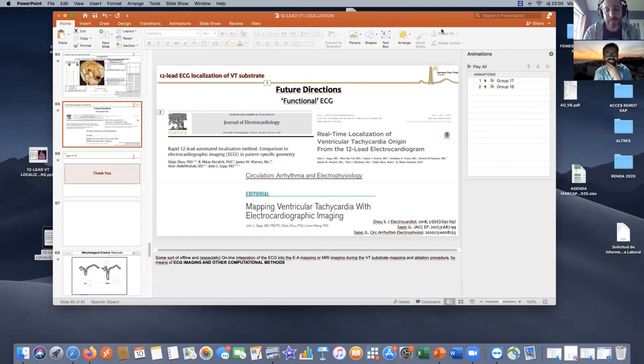In terms of anteroseptal substrate, comparing the classic ischemic anteroseptal substrate, from an occluded LAD or occluded diagonal, versus that non-ischemic substrate, which is less arrhythmogenic, but you see it from time to time. And as you mentioned, it tends to be a kind of protected substrate. From a pathophysiology point of view, we know they're very different. What are your thoughts on why this substrate in non-ischemic is so tricky to respond to ablation? Is it because it's mostly intramural? Is it because it's localized on a high septal site, and so accessing it is either difficult or limited by the nearby structures? You've got the coronaries, you've got the conduction system, you've got the outflow tracts right on top of it, you've got epicardial fat and so on. So what are your thoughts on this kind of tricky substrate?